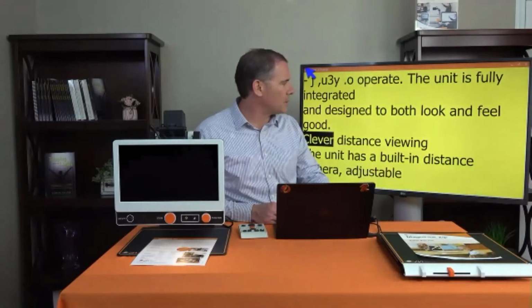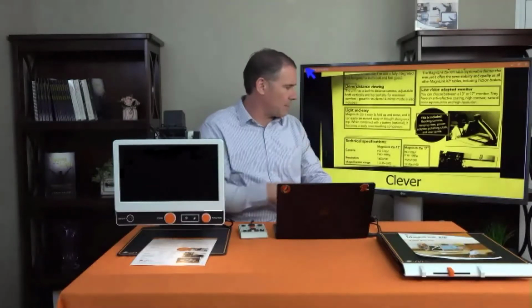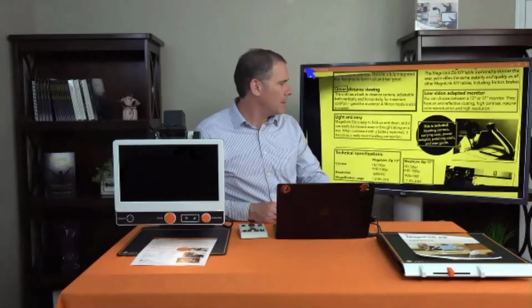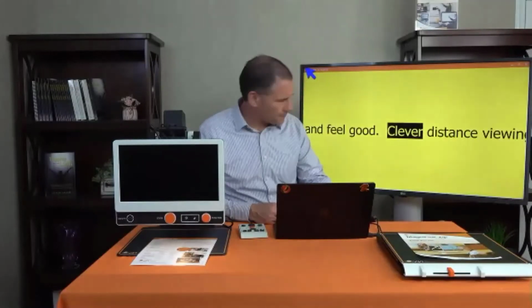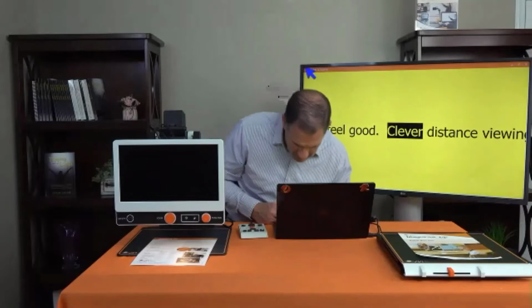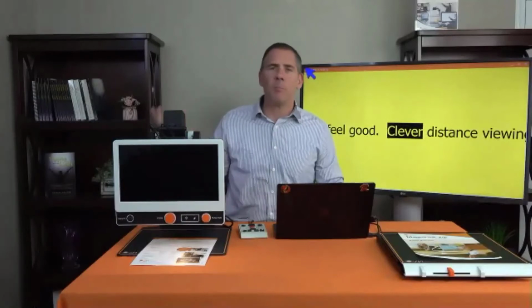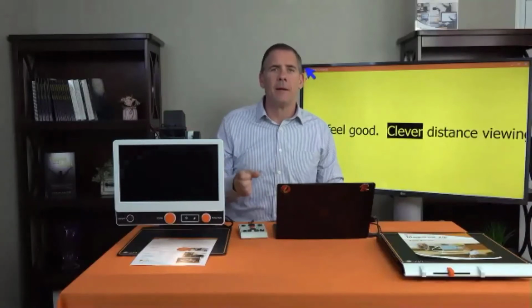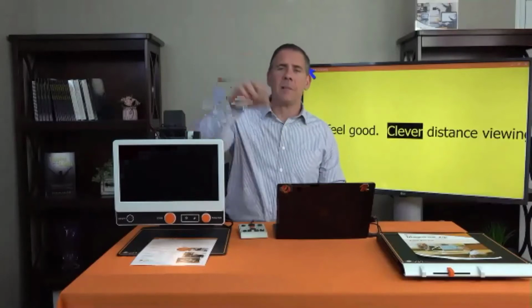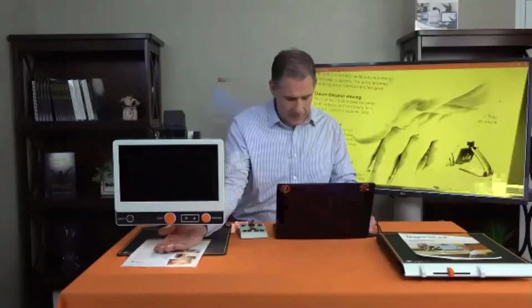But I can go to my large print, follow along, sentence at a time, word at a time, document and a word at a time underneath, sentence at a time, just the document and click around and read, or back to my large print. So what I did earlier was I hit the V key. V is view. So if I'm using OCR and I have Bluetooth headphones on, I'm listening to a document, I'm in a boardroom and they handed out a bunch of stuff and I'm taking quick pictures, and then they jump to something on the screen. I just hit the V key, see? And now I went back to there.